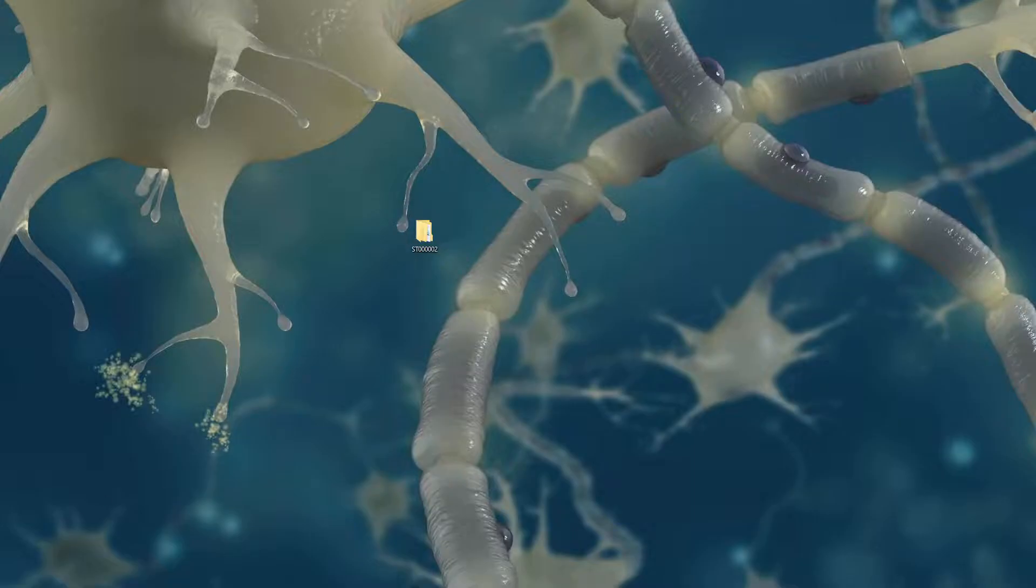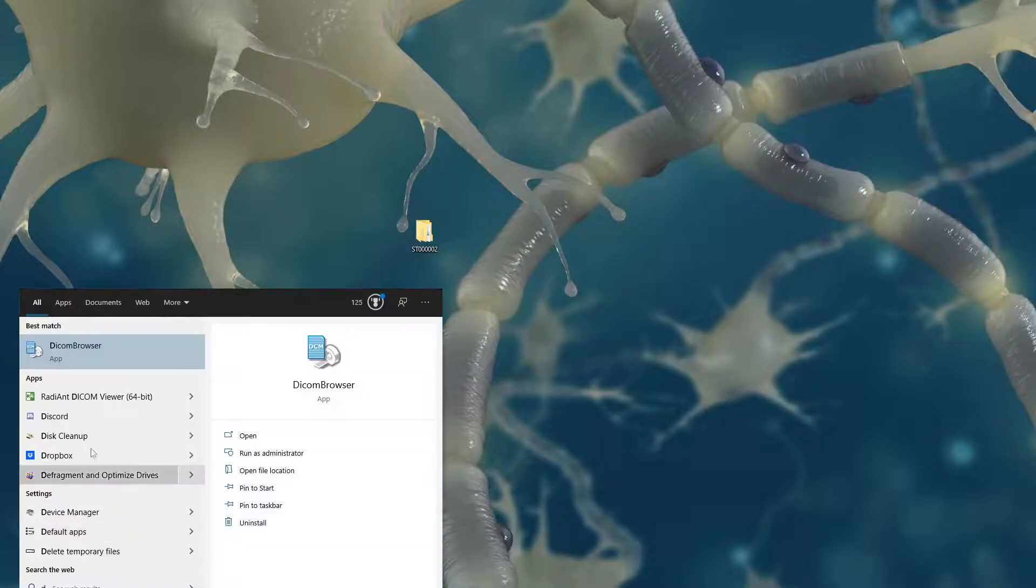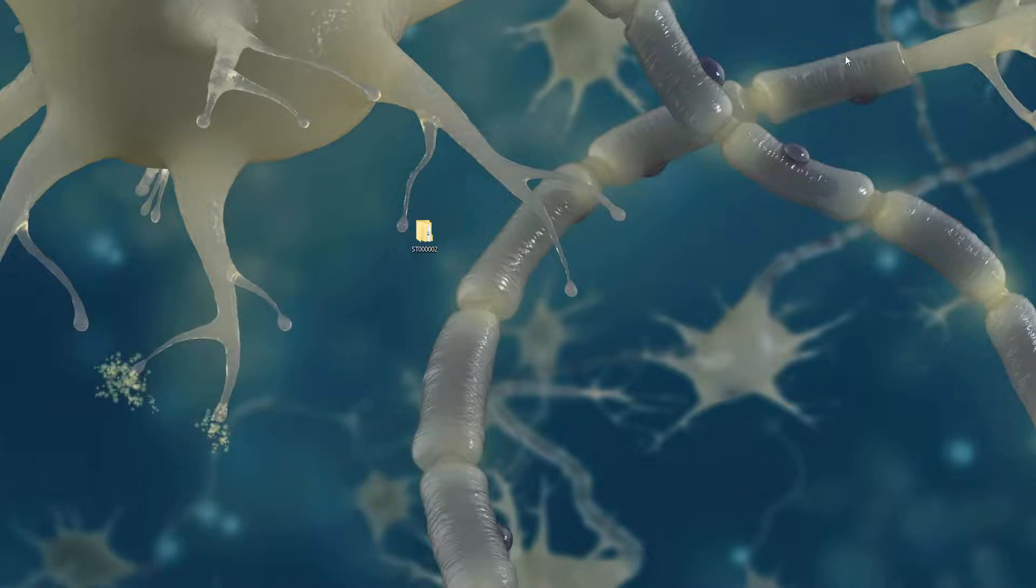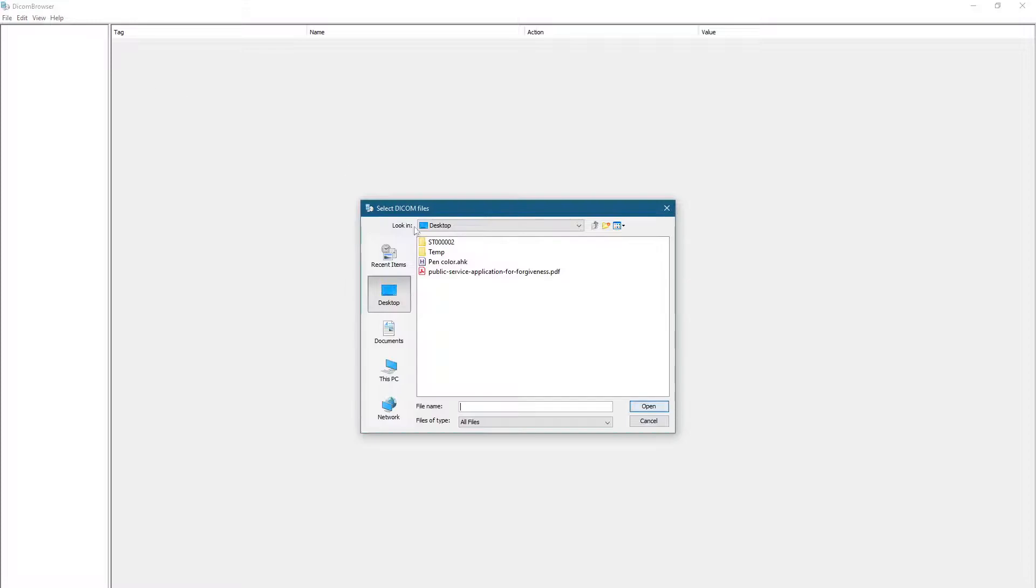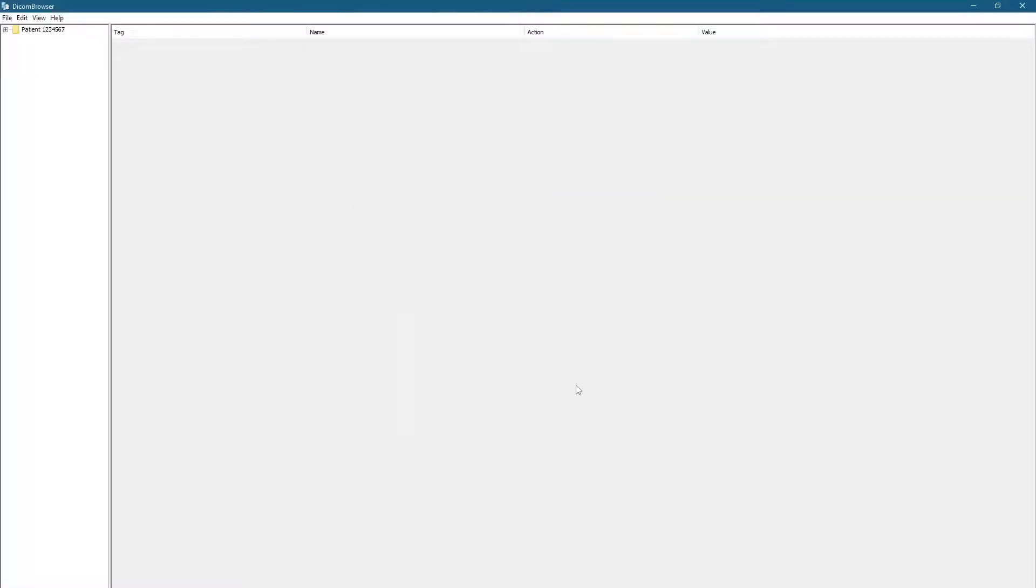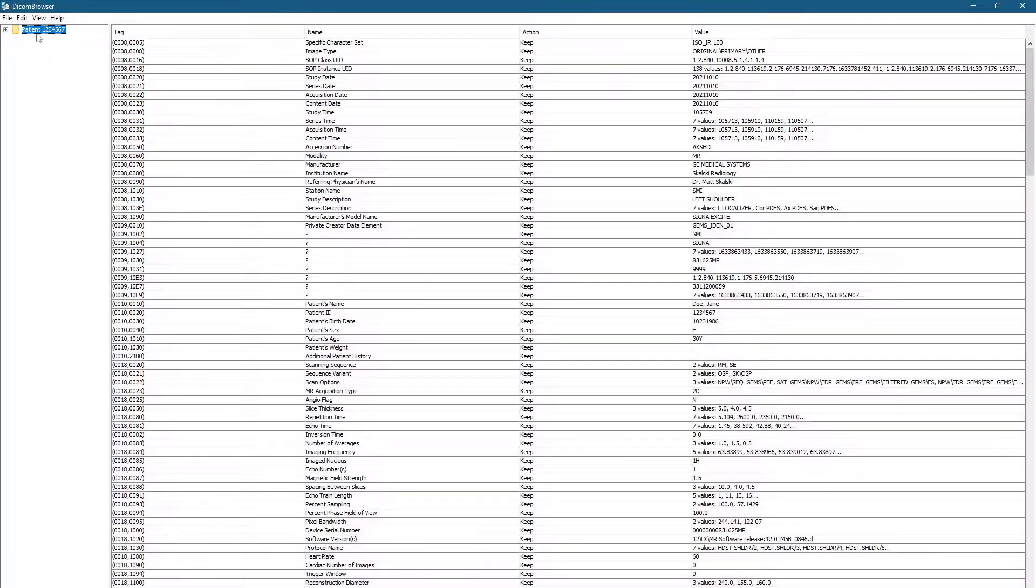And once you download that, I'm going to open up that software, and it's going to look like this. And so I'm going to go to File, Open, and I'm going to grab that folder, and here's the patient that I want to anonymize.